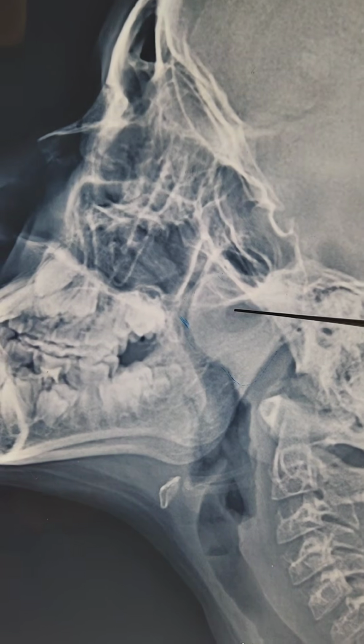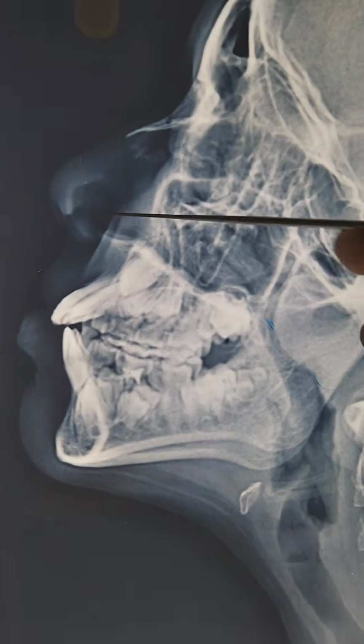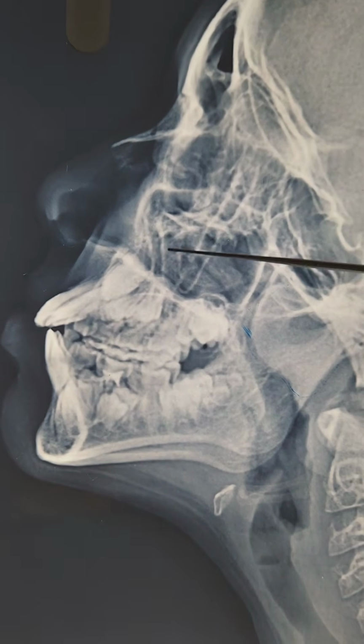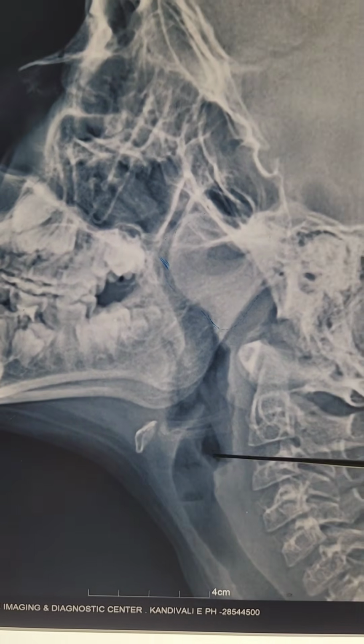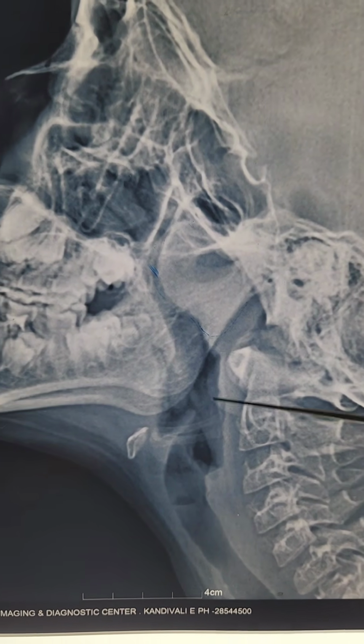So what you can see here on the screen is the adenoid tissue, the huge white shadow here. This patient has massive grade 3 adenoids. The air enters like this, inferior and posteriorly in the nasal cavity, and tries to go through the nasopharynx, down in the oropharynx, and down the windpipe. That's the windpipe, and that's the food pipe behind, and that's the spinal cord.